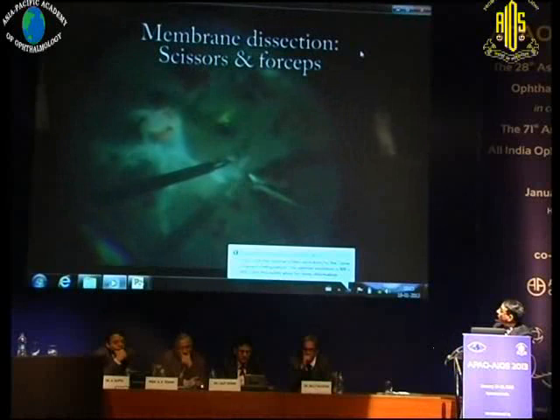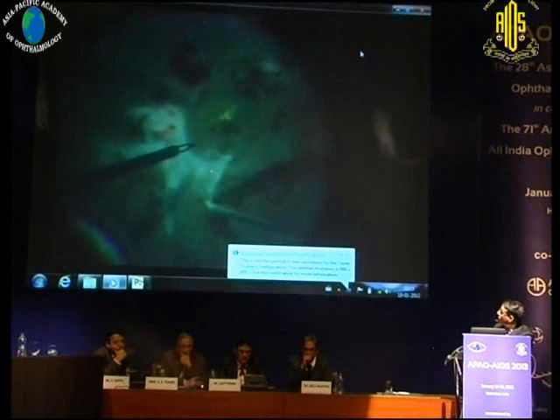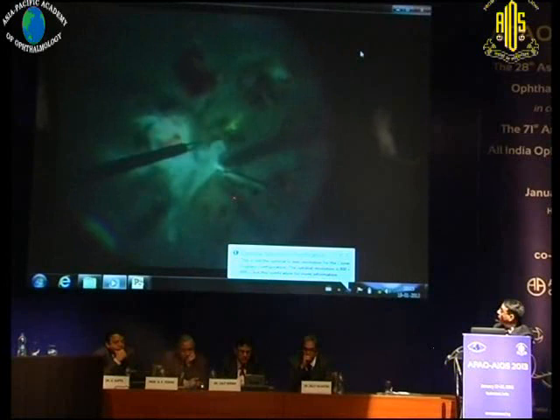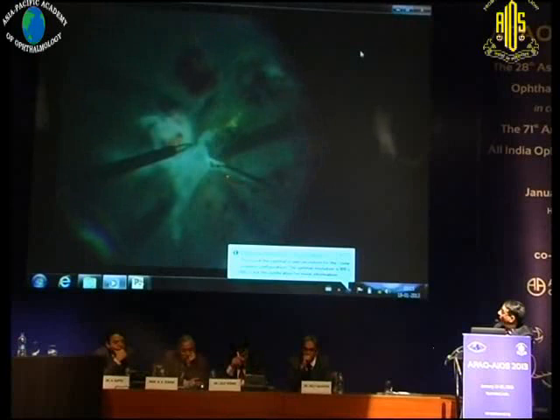This is a classic forceps and scissor dissection. Here you're working along the large temporal arcade vessel. Once you lift up this membrane, you can see each point of connection and confidently cut it without producing trauma to that major vessel or causing any bleeding.